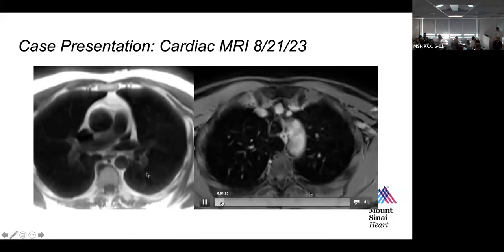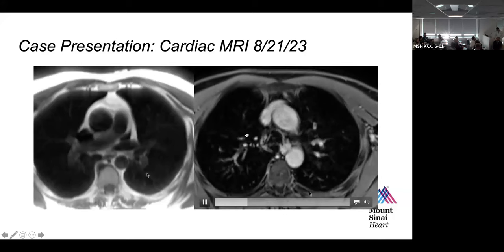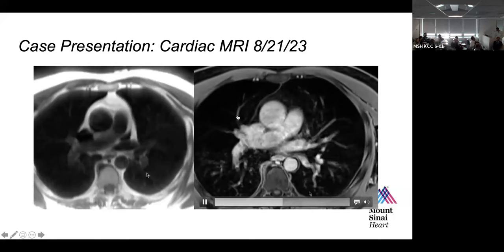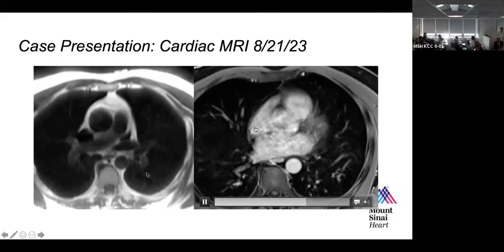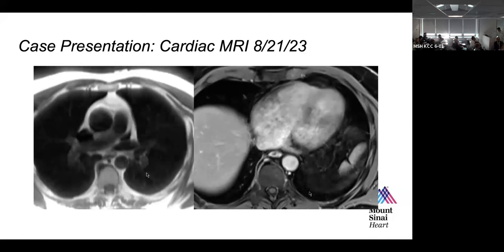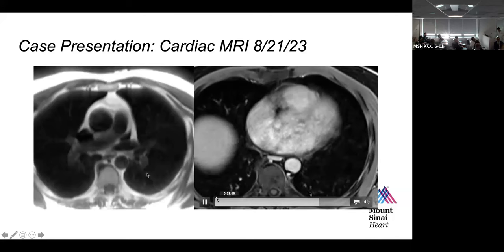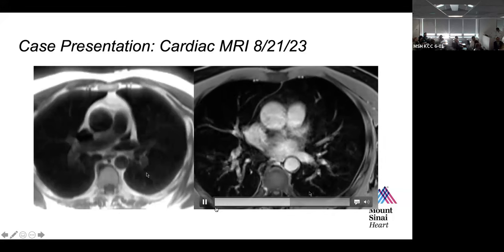I can see it coming from the right upper lobe, and I also can see the RPA right behind it, and I can see it join the SVC at the level of the right pulmonary artery below the azygos. And then right there where the pointer is, if you come up, you see that there is a deficiency in the posterior aspect, right at the SVC RA junction, so a little bit above. It gives you a hint.